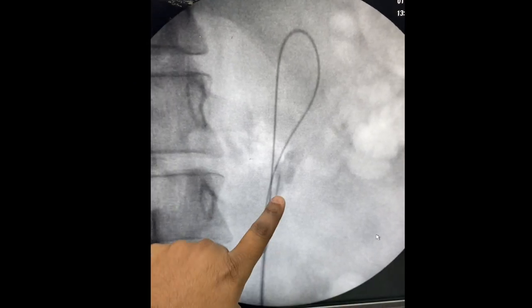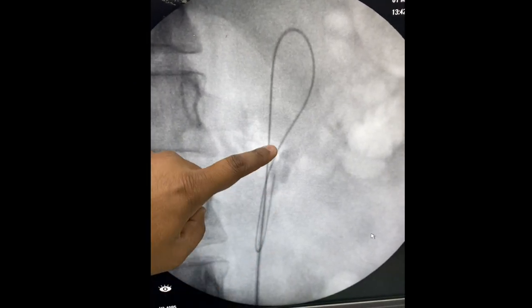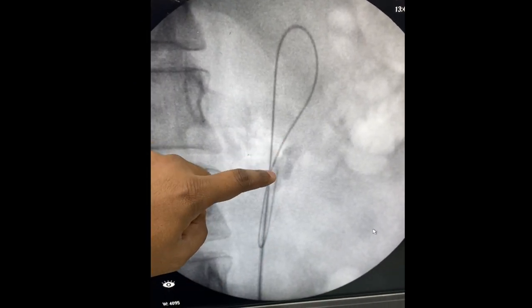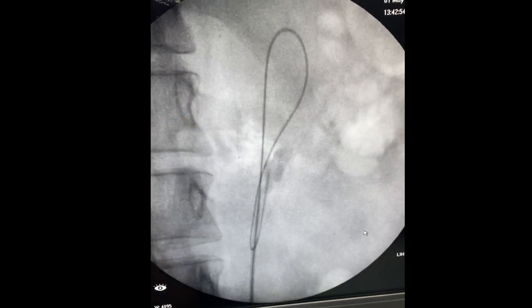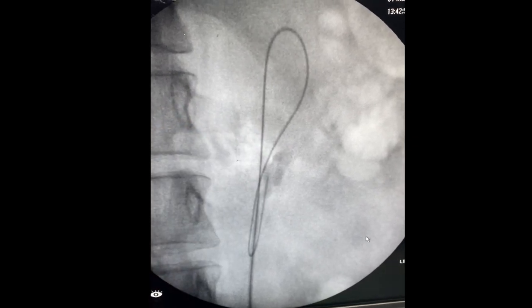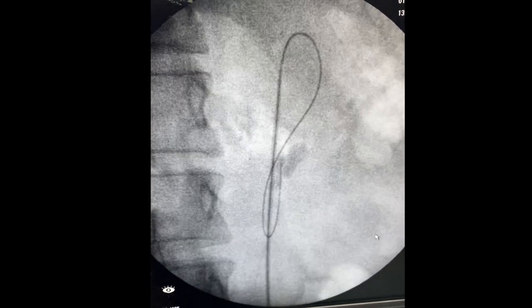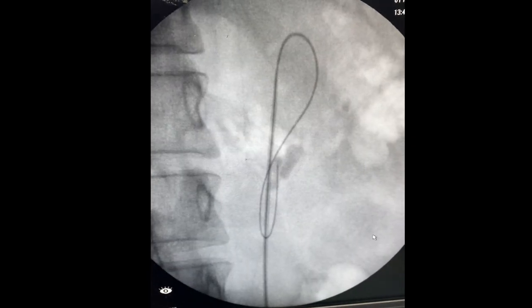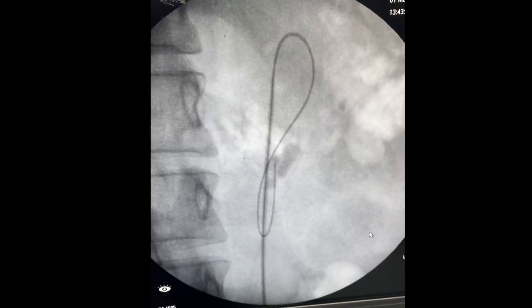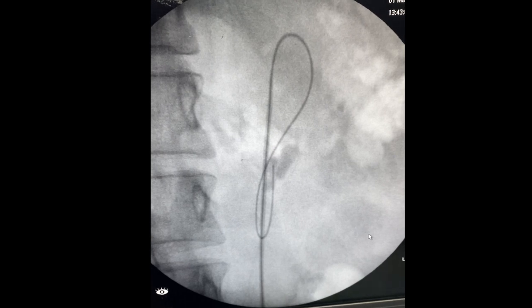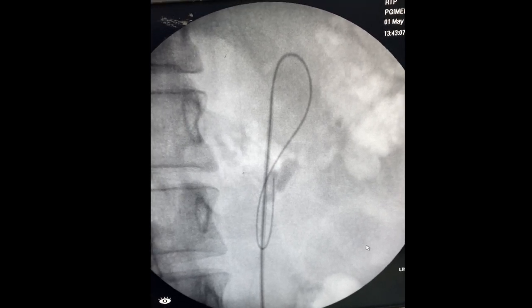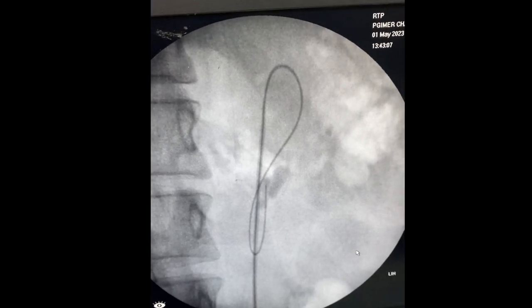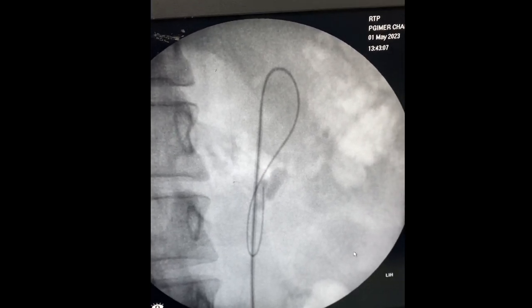This is the intraop fluoroscopy image. You can see the stone there, which is around 2.3 cm in size located at the level of the PUJ. We are placing the ureteric catheter initially over a guide wire, as shown here.